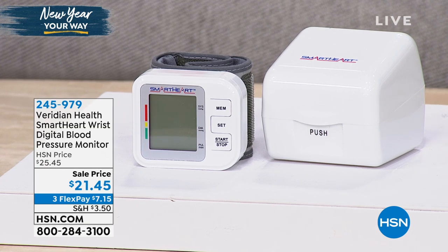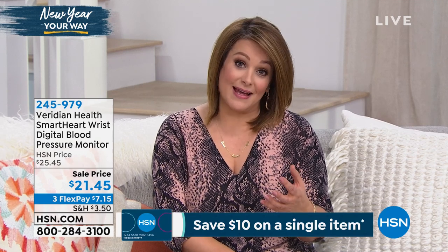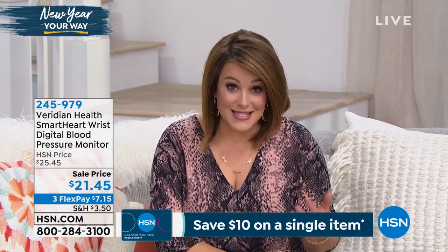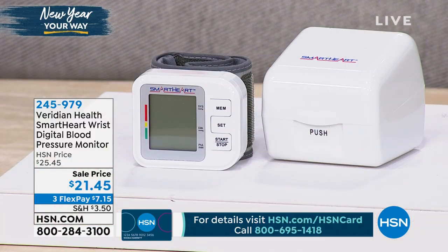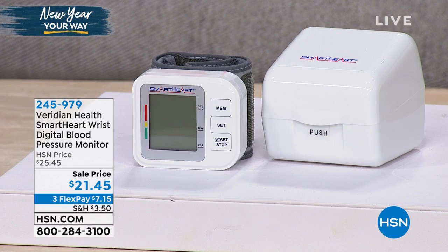How often are you taking your blood pressure? Probably not as often as you should. When you hear the statistics and read that high blood pressure is called the silent killer — because you don't have symptoms, you don't know what's going on — you're really going to appreciate this product, because now in the comfort of your home, no white coat or lab coat syndrome, you can take that blood pressure right on your wrist in an easy design.